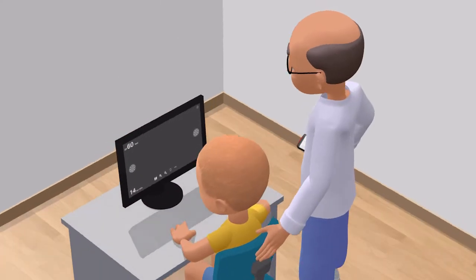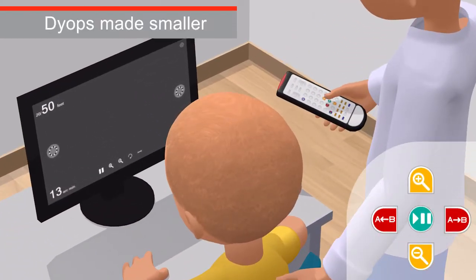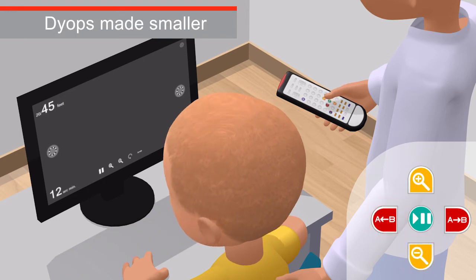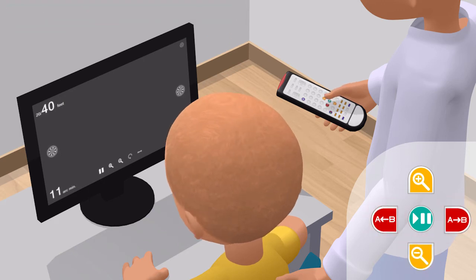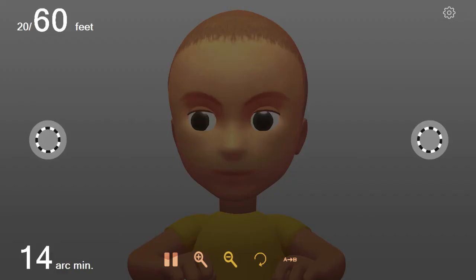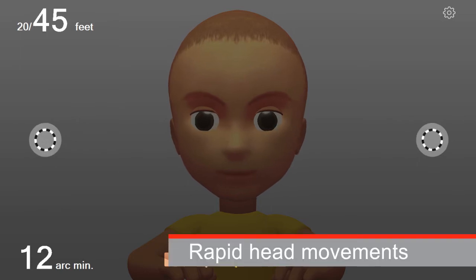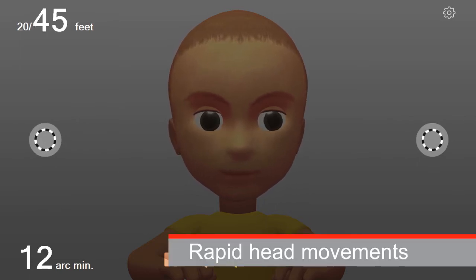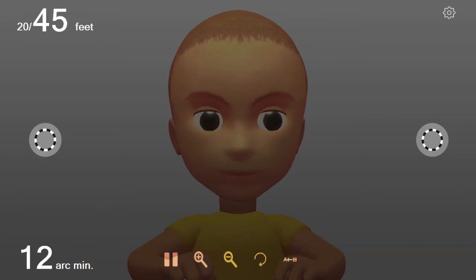As the examiner makes the DIOPs incrementally smaller, the location of the rotating DIOP alternately switches. The child's head or eyes will naturally move from side to side to track that rotating DIOP. When that rotating DIOP gets too small, the child's head or eyes will either rapidly move from side to side, or may not move at all, trying to unsuccessfully locate that rotating DIOP.